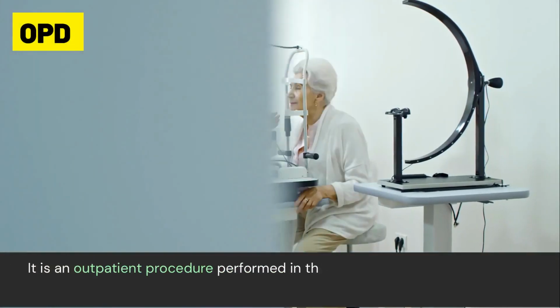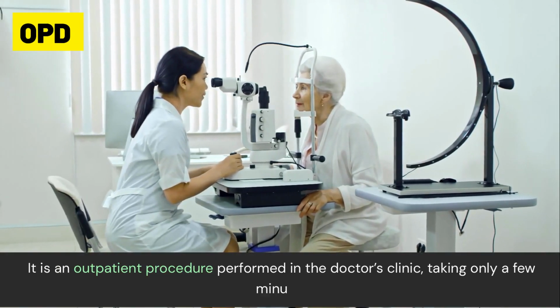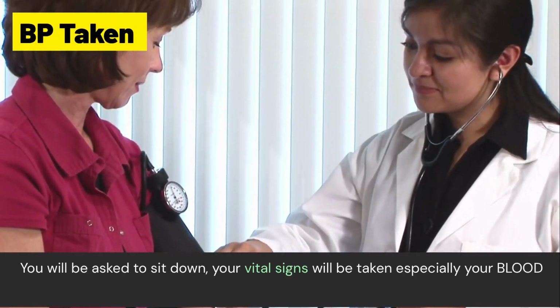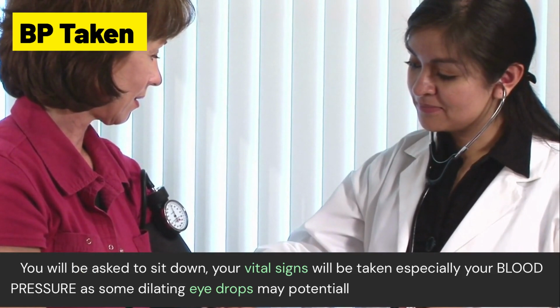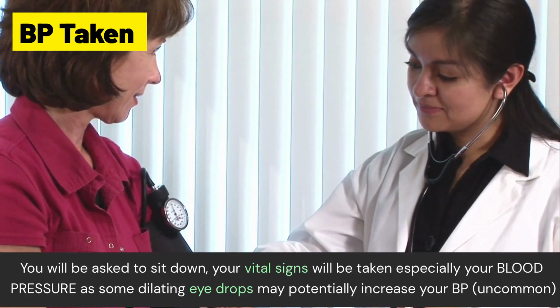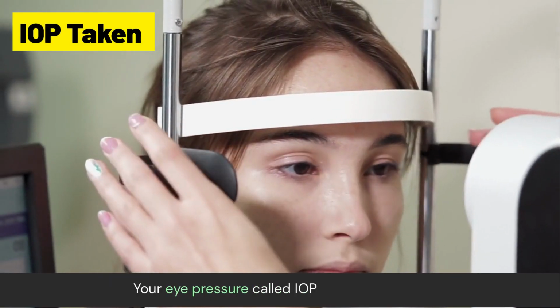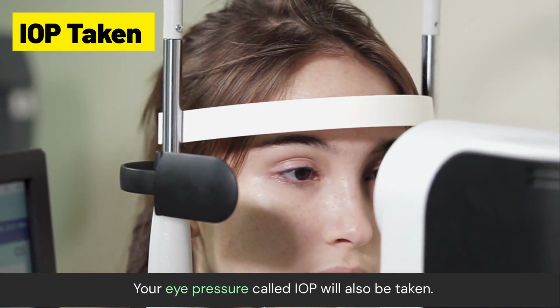Basically, it's an outpatient procedure performed in the clinic, taking only a few minutes. You'll be asked to sit down, and your vital signs will be taken, especially your blood pressure, as some dilating drops may potentially increase your blood pressure, although this is uncommon. Your eye pressure, also called IOP, will also be taken, and this measurement is independent of your BP.